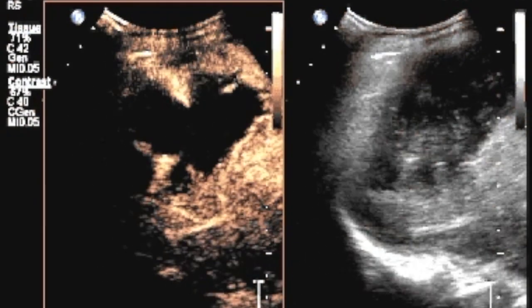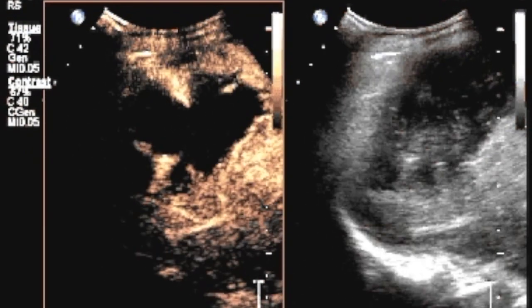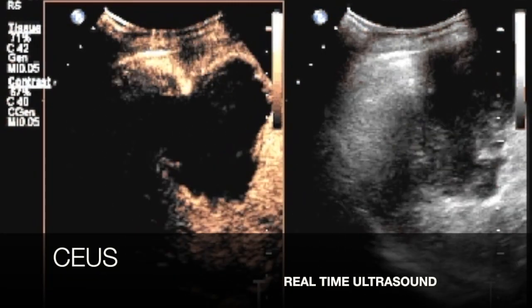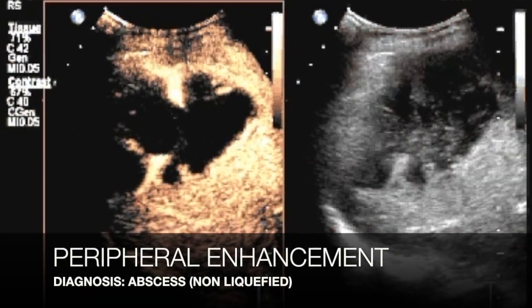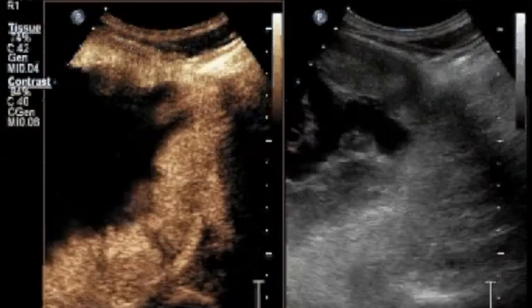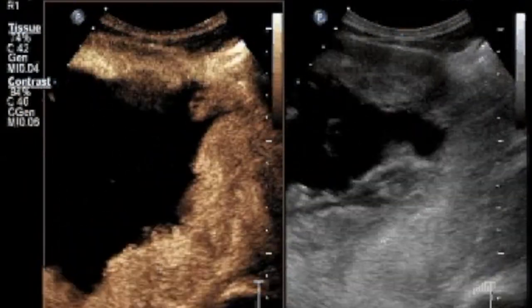These two cases exemplify how effective contrast ultrasound really is. In the first case we saw a solid appearing lesion on B mode, but when we performed contrast ultrasound we saw that there is only peripheral enhancement. So this was actually a non-liquified abscess. In the second lesion we were thinking in terms of an abscess because of the central necrotic area, but on performing the contrast study we see that there is peripheral nodular enhancement. So this was actually a typical hemangioma.